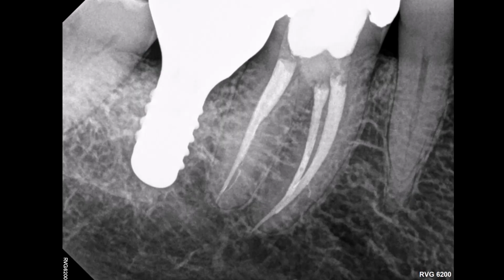You can see in this still photo that there is gross bone resorption. This was perforating resorption, and you can see the bone tissue directly exposed, which TCA has been soaked on. That exposed bone, there's no negative effect. TCA is a limited acid and does not harm tissues or bone. It is a safe liquid to use, and it's a very useful liquid to use in root canal treatment and resorption treatment. Here is the post-treatment radiograph.